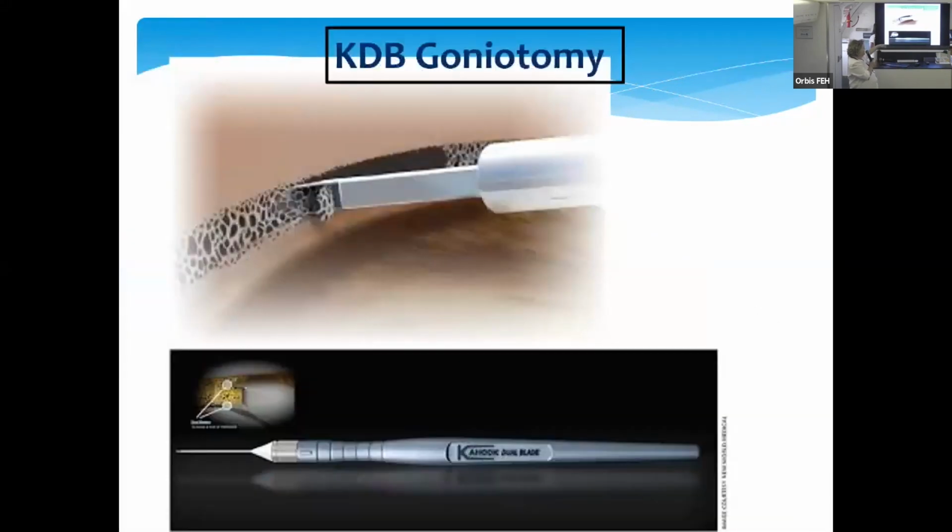Okay, the Kahook Dual Blade, this is what it looks like when it comes out of the package, like on the bottom of the slide. And then on the top is a diagram showing you how you incise the meshwork, and you're just scooping that trabecular meshwork. It's got almost like a little shovel on it, and it's just stripping the meshwork as your hand moves along. And again, you see those little tiny red dot collector channels, and they start to ooze because you've made a good communication with the aqueous veins. And it's supposed to leave you that nice smooth edge like in this schematic, and not leave a lot of leaflets to scar.